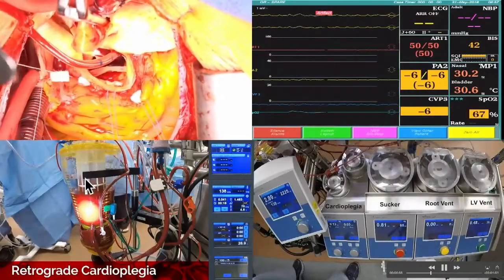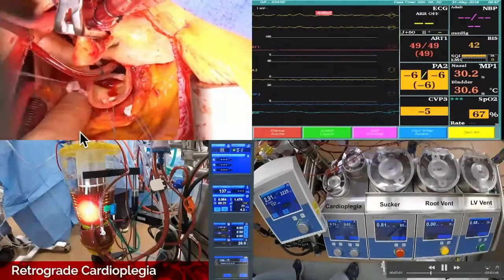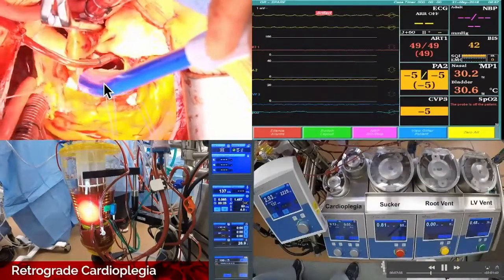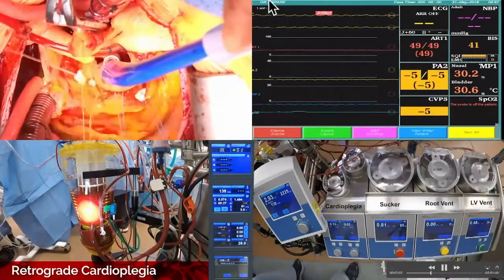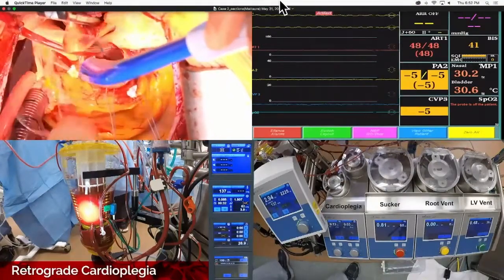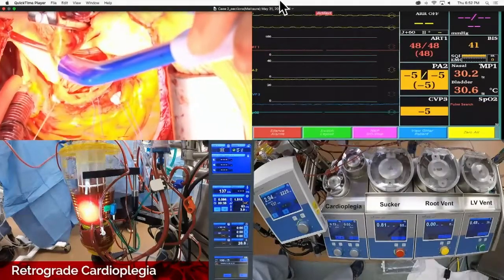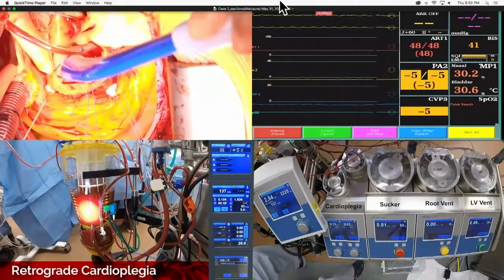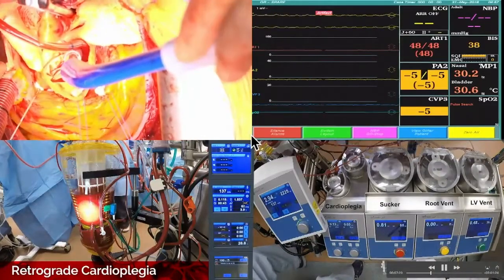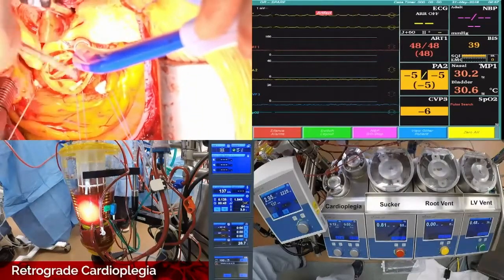There's the level right there. I remember this being really dark blood coming out. And that's the thing. It passes through several inches of heart, oxygenated, and comes out dark, venous. It's pretty impressive. And that's a real good sign that O2 has been extracted, amongst other things. That's what you look for, right? Exactly. The potassium and everything else.